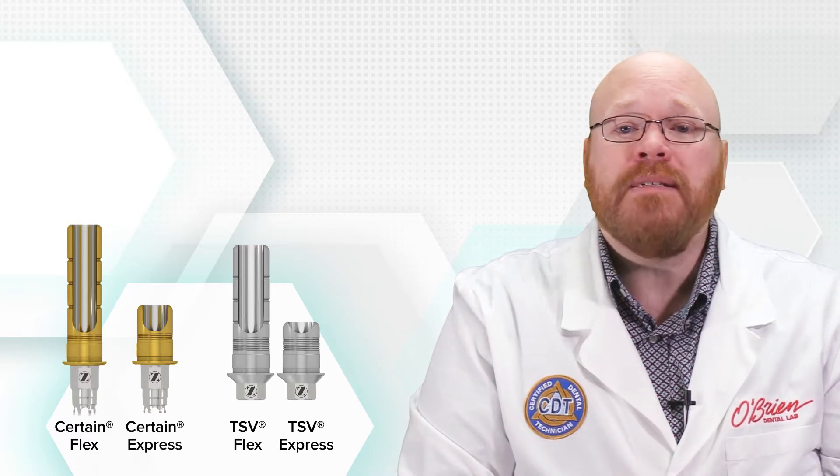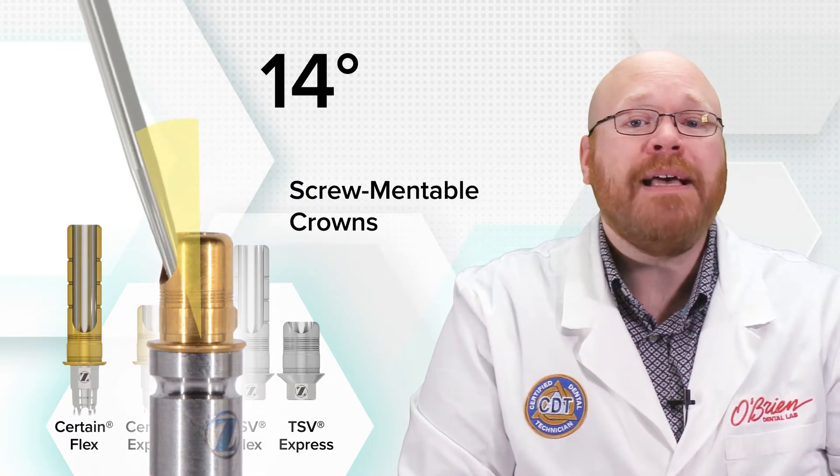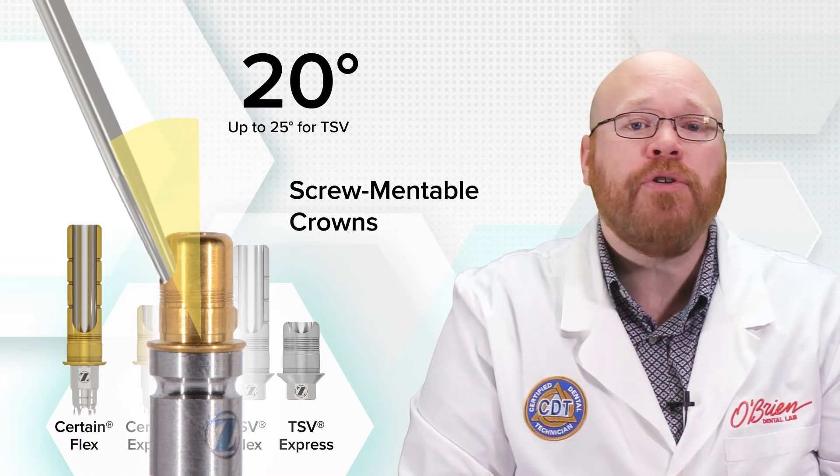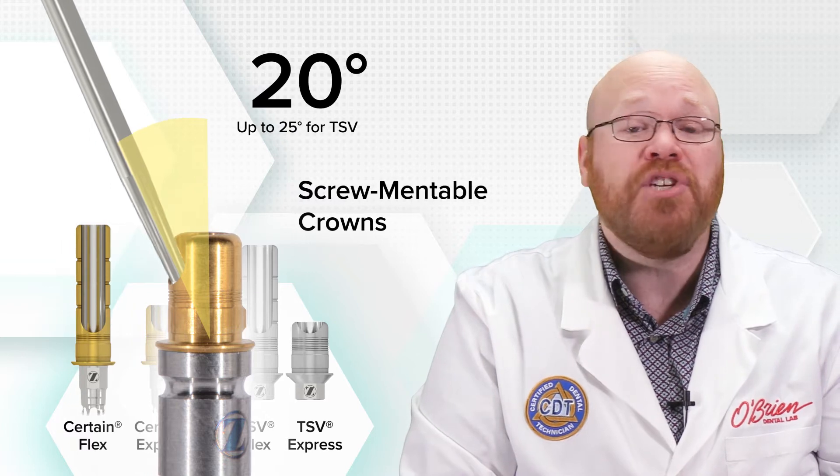The Flex and Express are stock titanium bases that are used for screwmentable crowns, and they allow for up to 20 degrees of angle correction, which is great for situations where screw retained restorations traditionally wouldn't work.